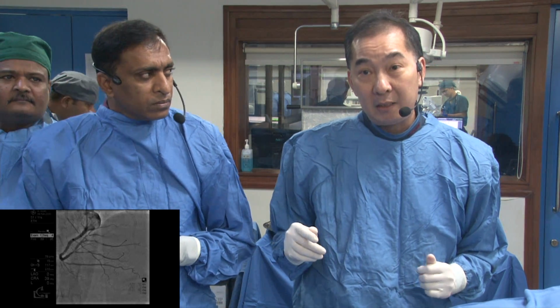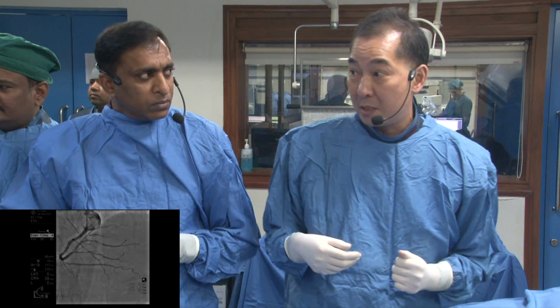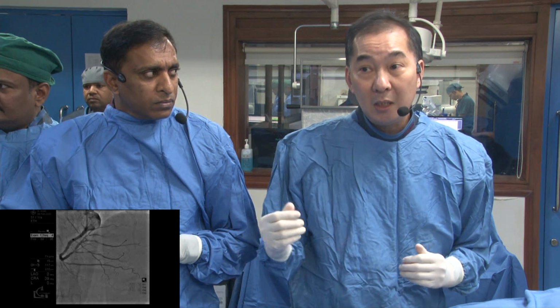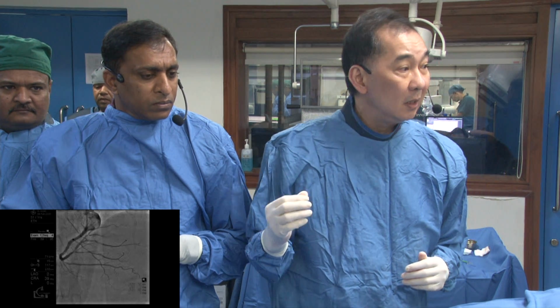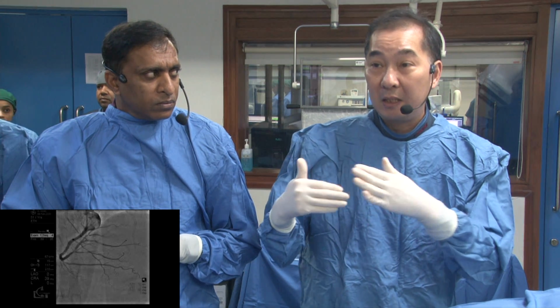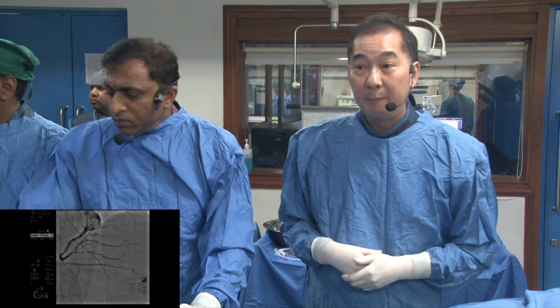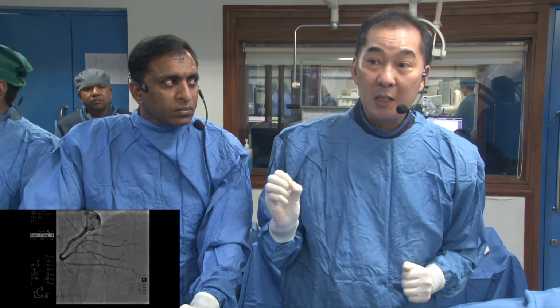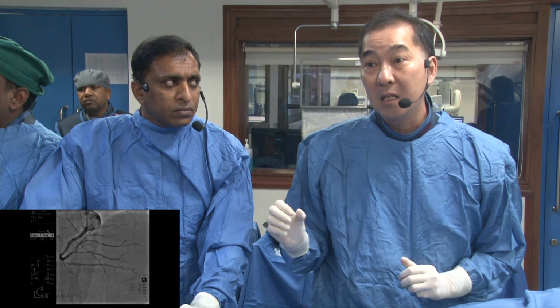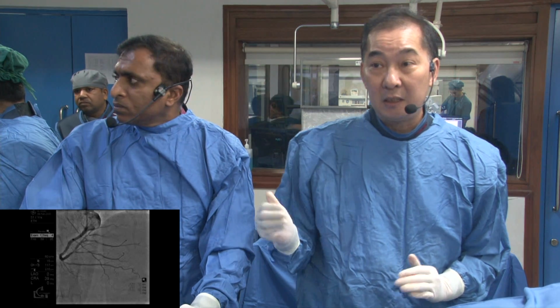If I put a bare wire in, I think there's a high chance of side branch closure, especially when I see this OCT finding. If I put a balloon protecting the side branch, I might inflate it very gently, 2 to 4 atmospheres, into the side branch alongside the stent, and do a small kissing on that, and I think we can protect the side branch. This side branch, I don't want to lose it. My bottom line is to try to maintain the flow even though the stent is deployed.